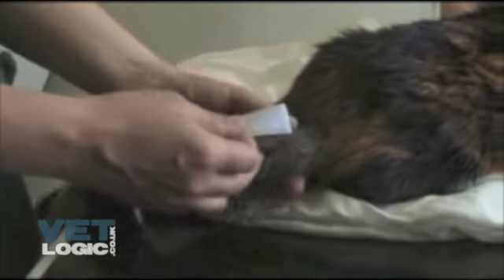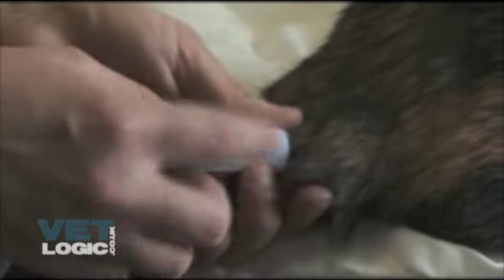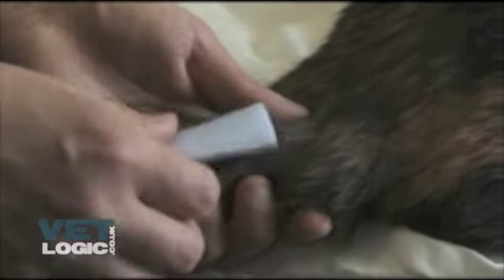The method for measuring systolic blood pressure on the tail is the same as for the forelimb. The only difference is the position of the blood pressure cuff and Doppler ultrasound probe.